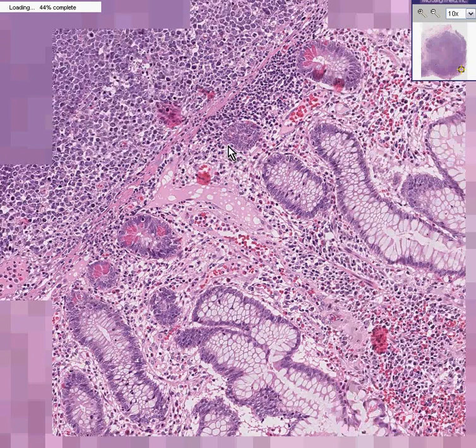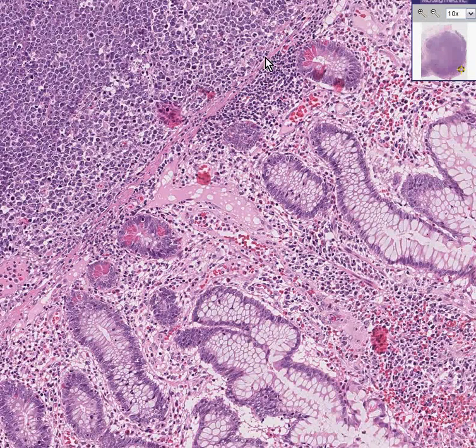You can see an intact muscularis mucosae. You can see the normal distribution of cells and vessels and lymphatics between the glands, also within the lamina propria of the mucosa. And of course, it is not unusual to have a lot of lymphoid tissue within the submucosa.